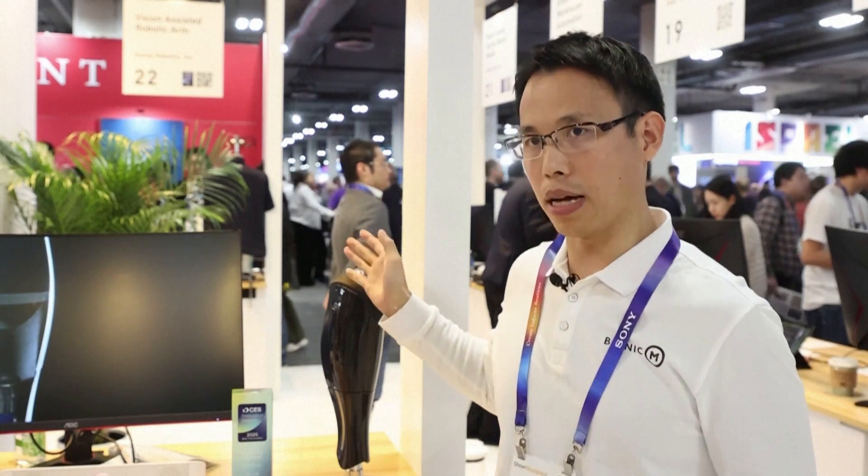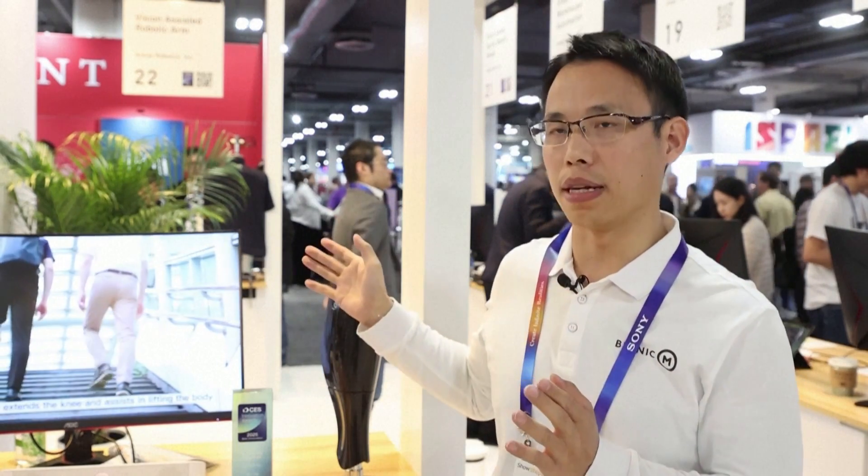This back leg is a robotic prosthesis, totally different from current products available. Current products on the market are passive, which means there's only bone and joint without muscle. You can imagine what will happen if you are losing muscle. This one has muscle, and that makes a big difference — this muscle can help patients do something they couldn't do.